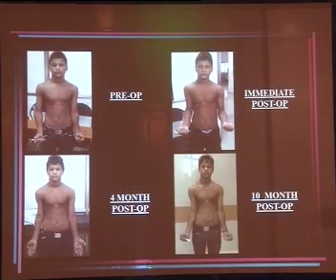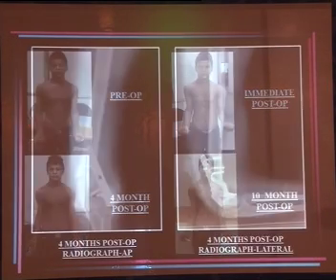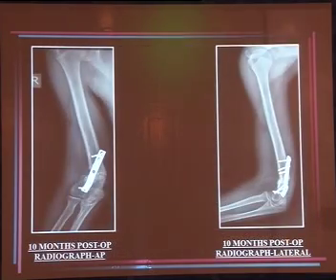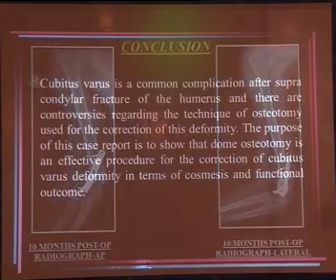The clinical photos: pre-op, immediate post-op, 4 months and 10 months post-op. This is a follow-up radiograph at 4 months. This is a follow-up radiograph at 10 months.